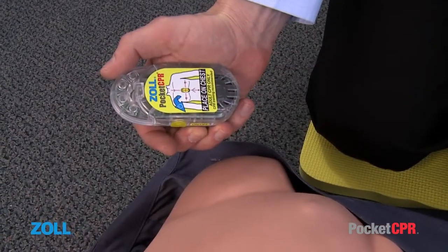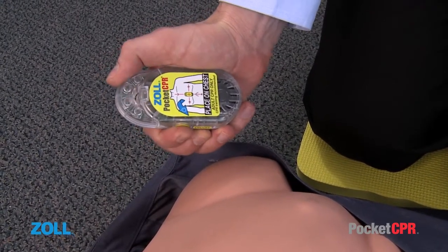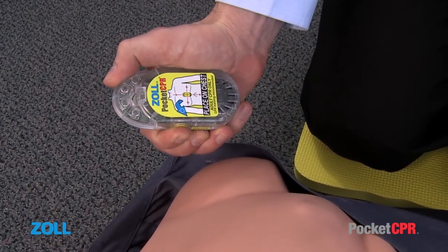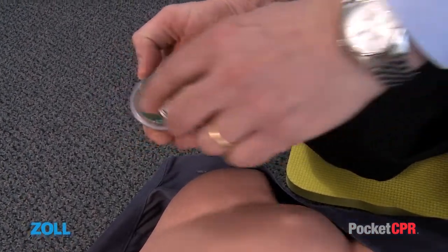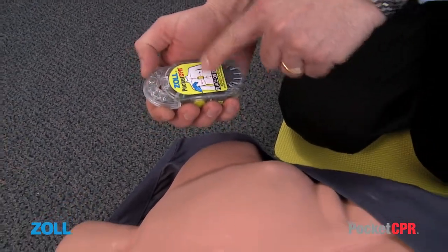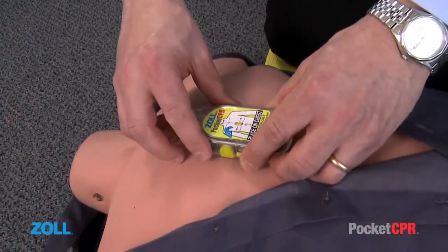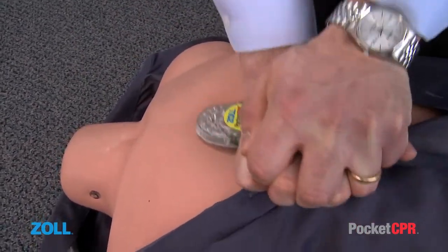To operate the device in silent mode, power it on by pressing and holding the power button until you hear it say, Stay calm, but continue holding the power button for another full second. Peel off the adhesive backing and place the device on the center of the patient's chest, following the diagram on the label. The device will begin flashing at 100 per minute.